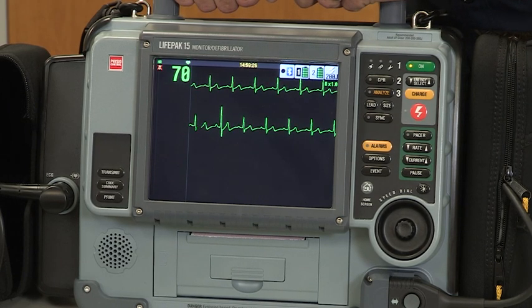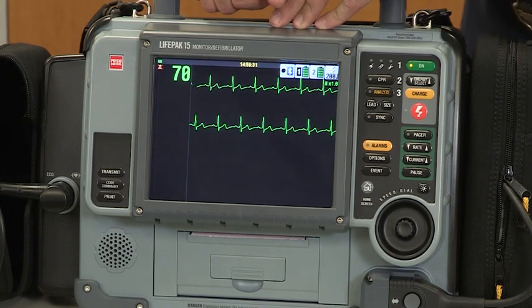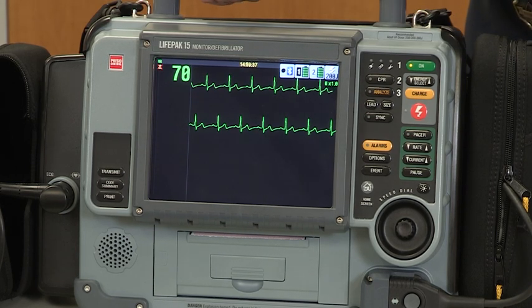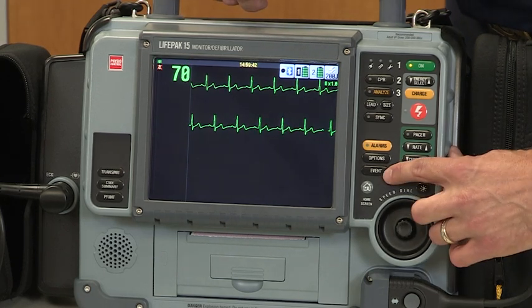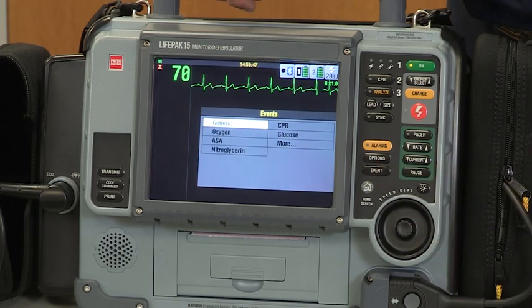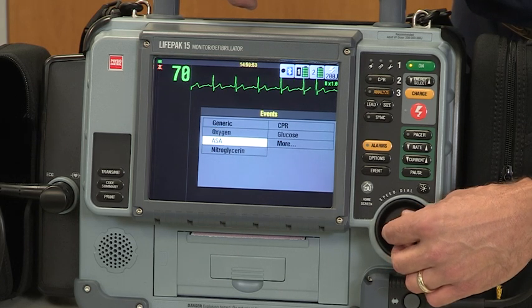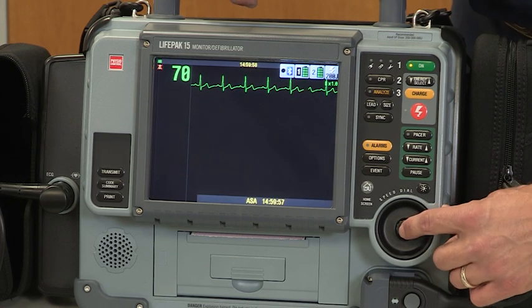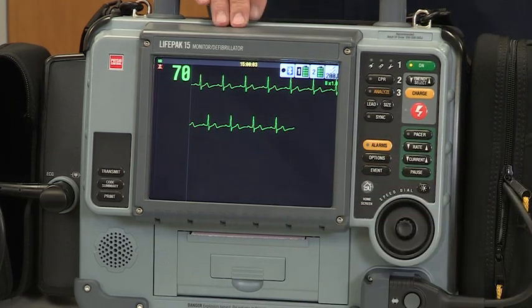One of the other features that the LIFEPAK 15 now has is the ability to record events, such as when you give somebody aspirin, glucose, or assist somebody with nitro. If you'd like to record that on the machine and have a printout of that, you simply go to the Events button, depress it, and it'll bring up the different options that you have. Say you gave somebody aspirin, you just use the speed dialer to select aspirin, press the center button, and it's going to timestamp that you gave aspirin, 14:59:57, and that'll be on the machine for a printout.